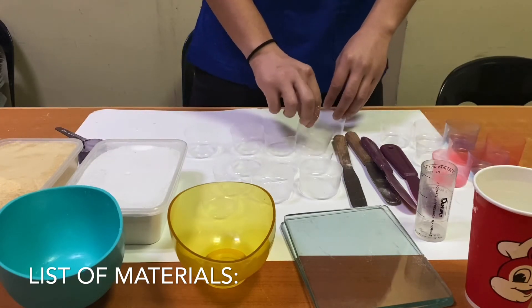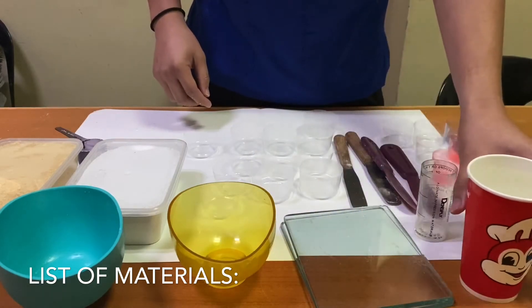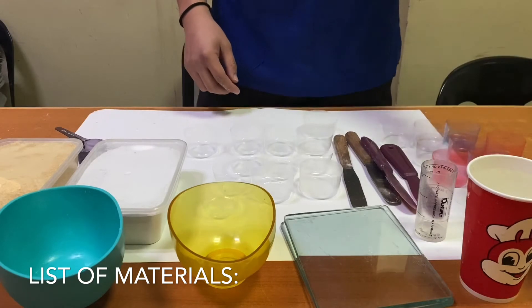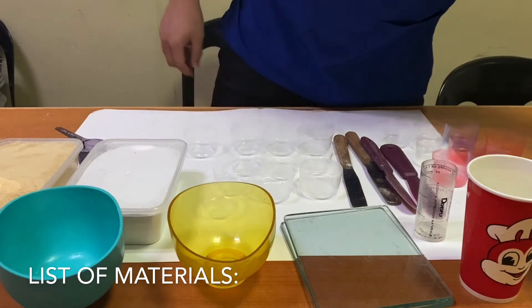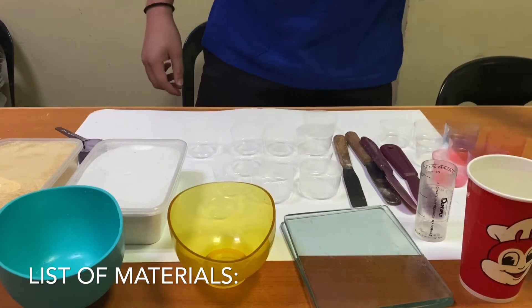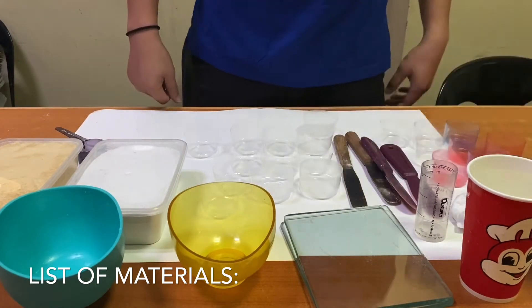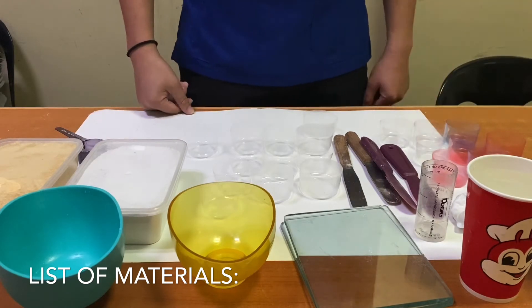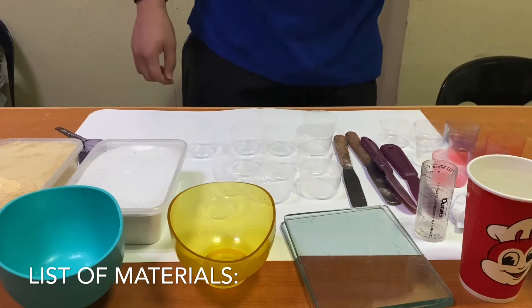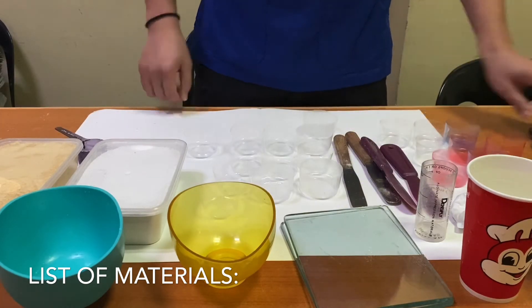Cold water, one cup; room temperature water, three cups; hot water, one cup; borax, one teaspoon; salt, one teaspoon; sewing needle, two pieces; watch, newspaper, and lab gown.